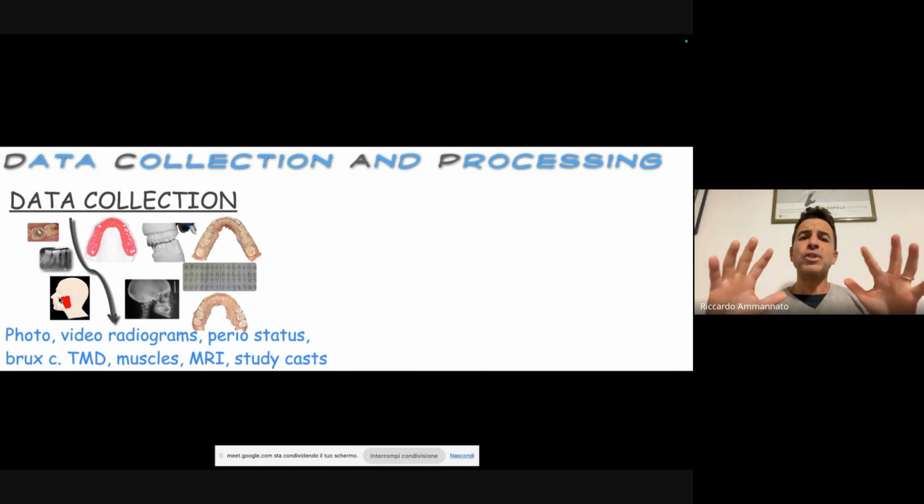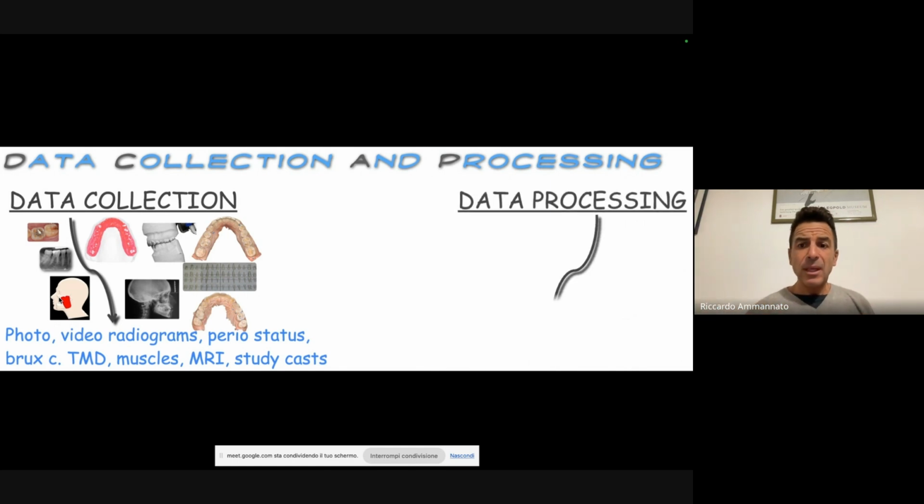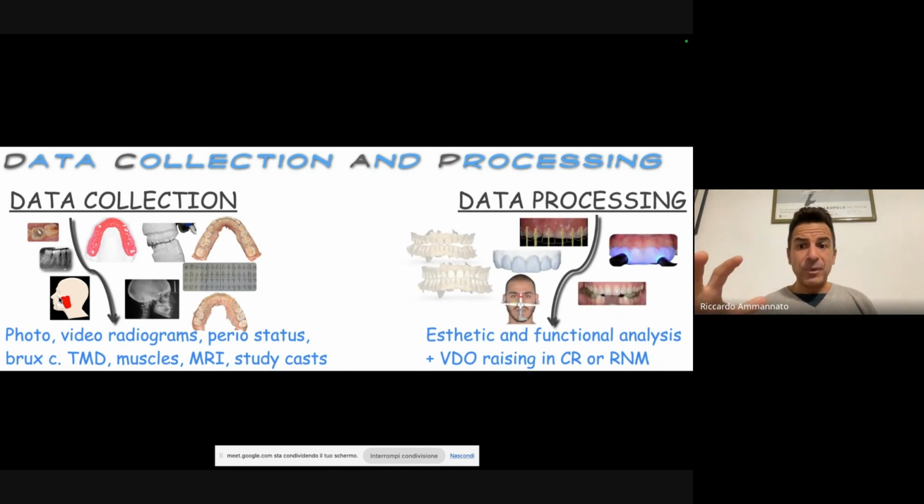We need also to do something very important, which I do in my protocol in all these cases: checking the muscles and checking the TMJ, all that kind of stuff, which is very important to integrate in the teeth. We have a system around our dentition that must also be taken into consideration, especially in this kind of case. So when we gather all the data, we then need to do our data processing, okay?